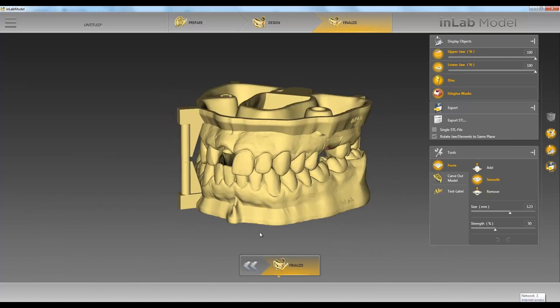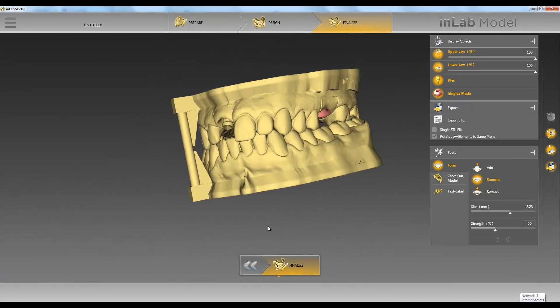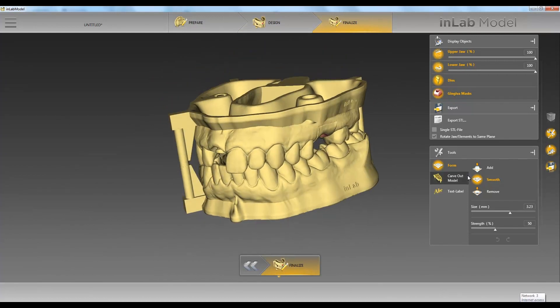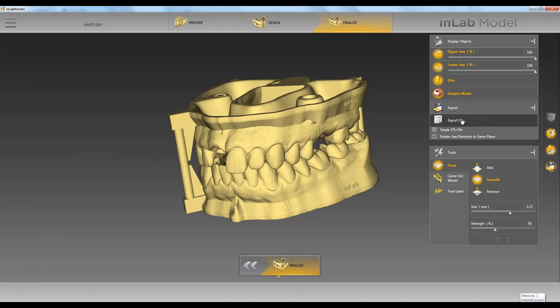Once your model is where you want it you can go ahead and export the file. We'll click export file right here and export it as an STL. If you have this unchecked right here you'll have four separate STLs.